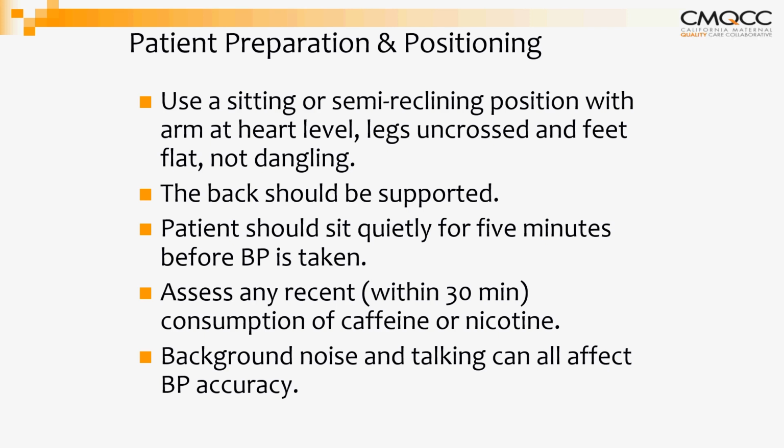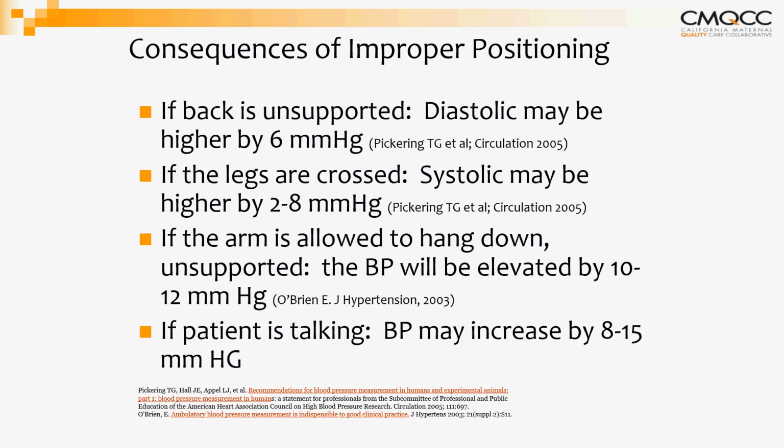Give her a few minutes to sit quietly if she's just come into the unit, and ask whether she's had any nicotine or caffeine in the last 30 minutes. So don't forget things like not just coffee, but any sodas, any Coke products, or anything like that. Sometimes we are guilty of asking them questions while we're taking their blood pressure as well. And again, we may not realize it, but that can also give errors in recording of the blood pressure. Next slide, please.